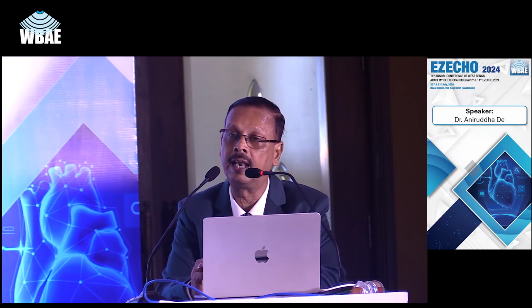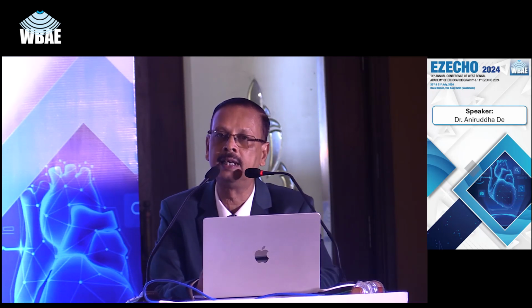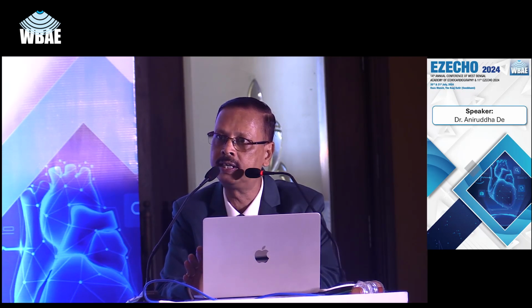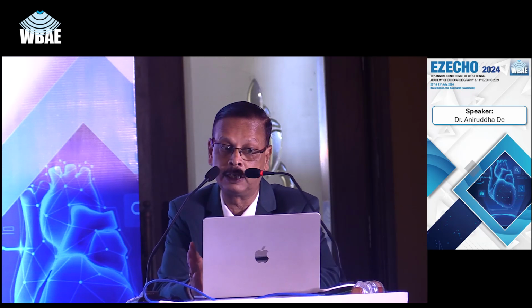Even the lack of variability is a very important factor, because E velocity despite the variation of the RR interval is highly suggestive of increased LA pressure. So if you take the mitral E velocity in case of atrial fibrillation, you'll get this sort of variability. Either you have to average 10 beats or you have to wait for this type of picture where there is only 10 to 20% variation and take the measurement here. And this variability is reduced in a patient, particularly where there is an increased filling pressure, making it a possible determinant, although it is a qualitative one.